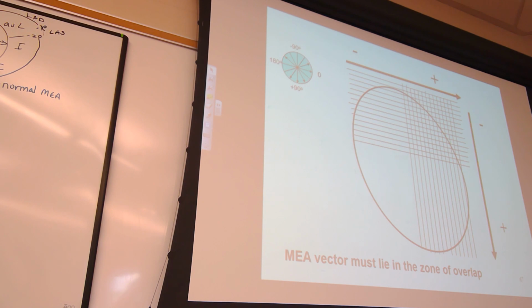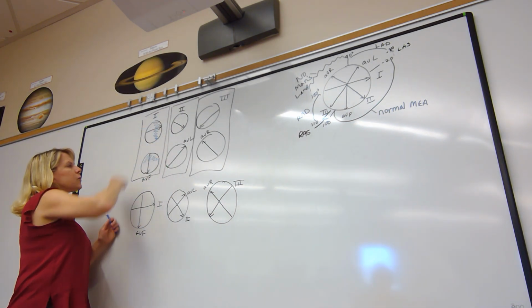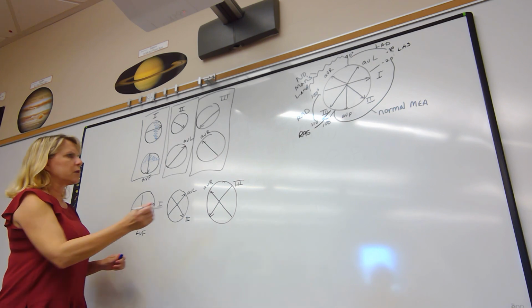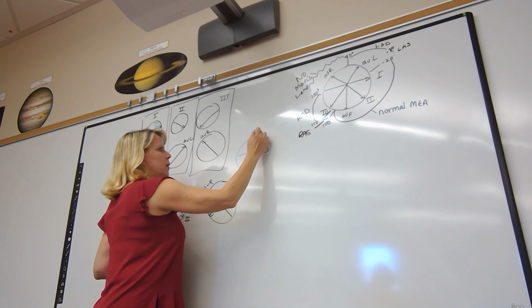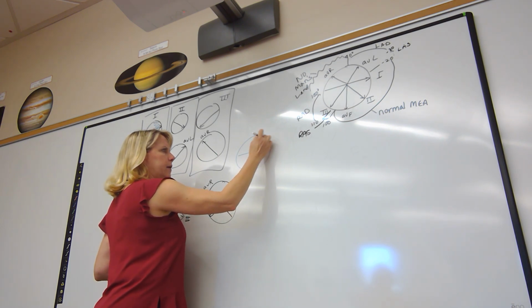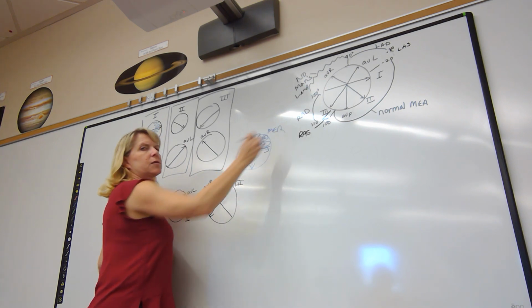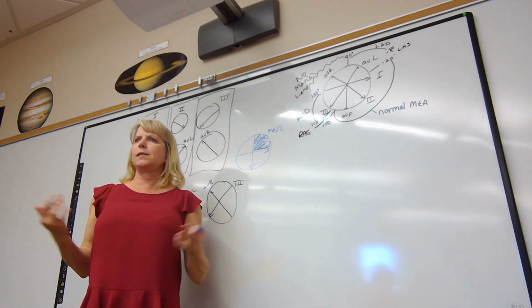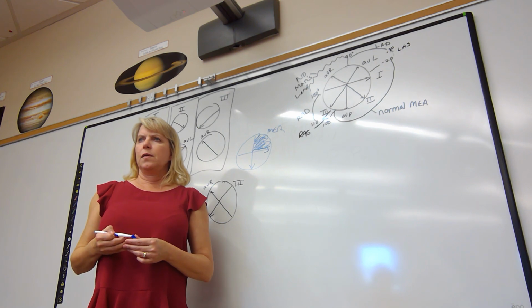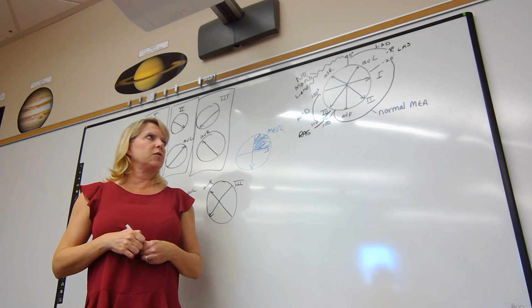So if you look at my picture here on the side, if I superimpose these two pictures, do you agree that I would have a circle where I would have the heaviest shading here? Well, that's where your patient's MEA is, roughly. It's a rough estimate. It's not exact, it's a rough estimate. It's good enough. This would be suggestive of an LAD, left axial deviation.